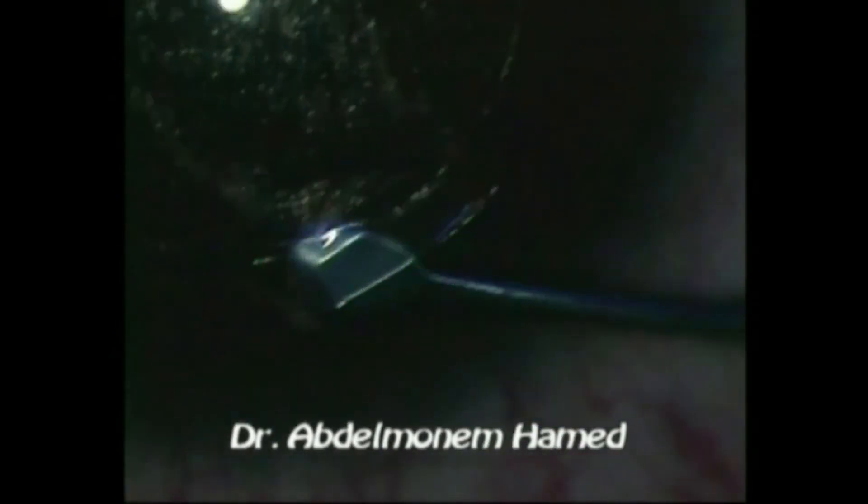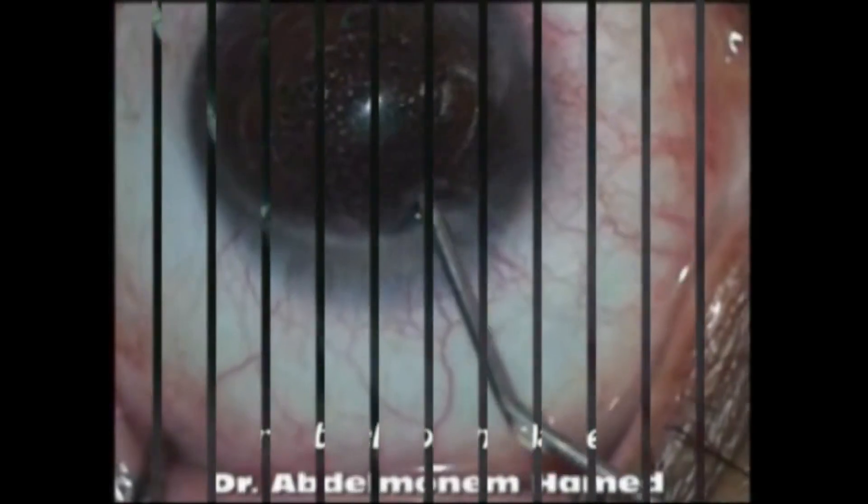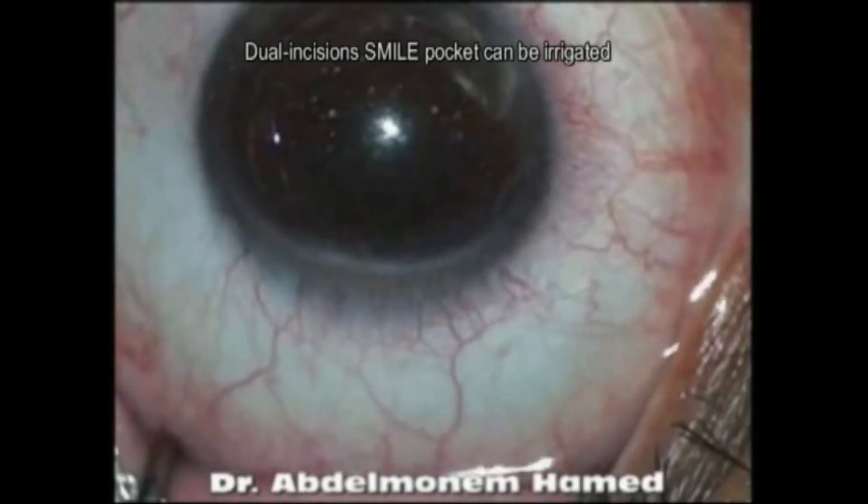We believe that adding a second side-cut incision at 270 degrees will act as a second hand for the refractive surgeon, facilitating management in a plethora of situations ranging from epithelial ingrowth and inflammatory infiltrate, etc.